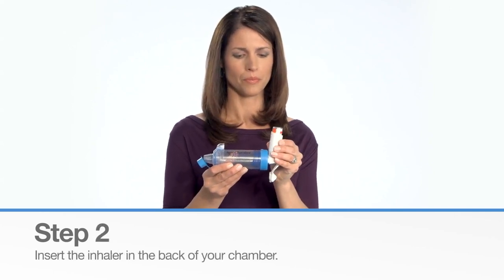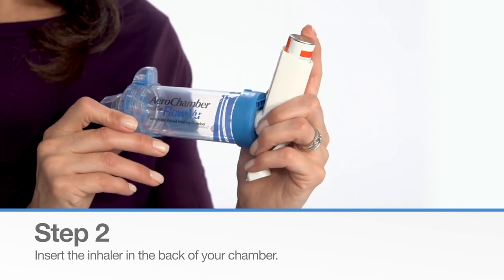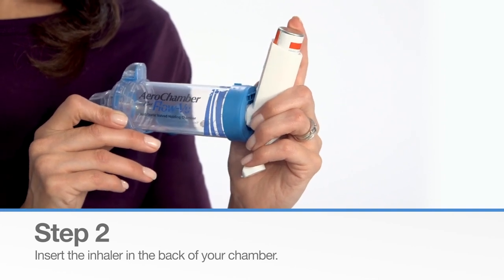Next, insert the inhaler into the back of your chamber. The AeroChamber Plus FlowView Chamber includes a flexible back piece that can be used with all commonly prescribed inhalers.